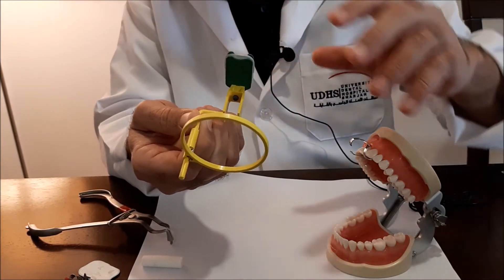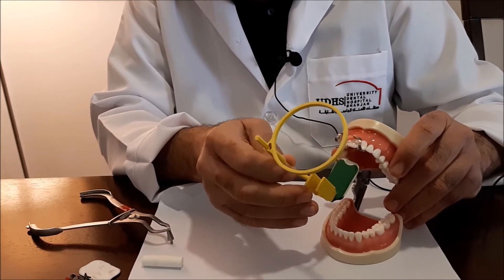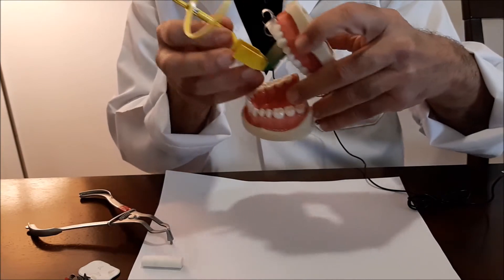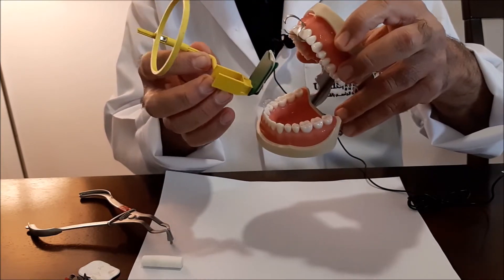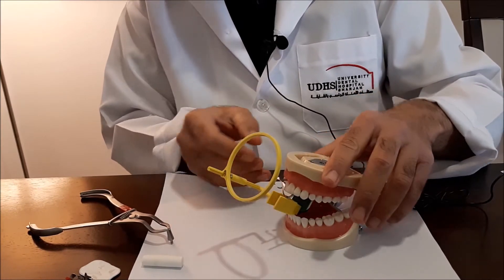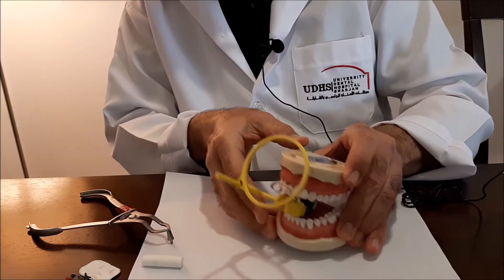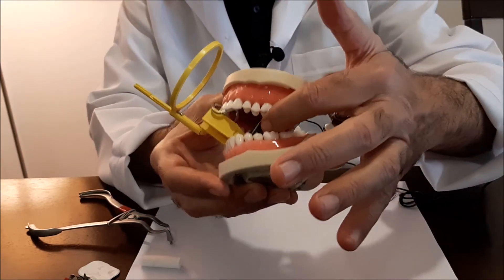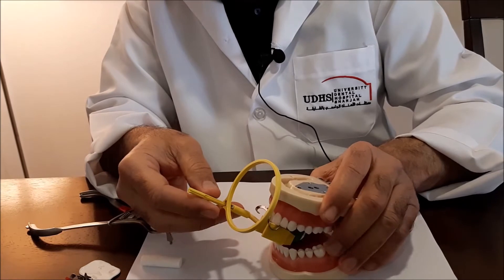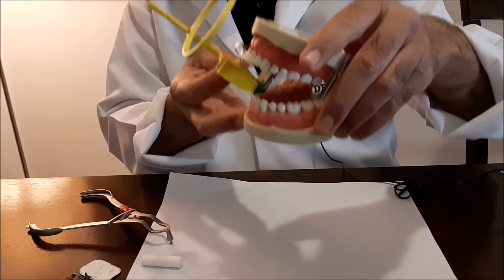We place it in the designated position and then take the radiograph. The principle is clear: we want the tooth and sensor to be parallel. Ask your patient to open, then place the sensor. The reamer extends through the opening and we try to maintain a parallel relationship between the tooth and the sensor. In most cases the error is placing the sensor too close or extending it too far outward, which decreases the chances of capturing the apex.